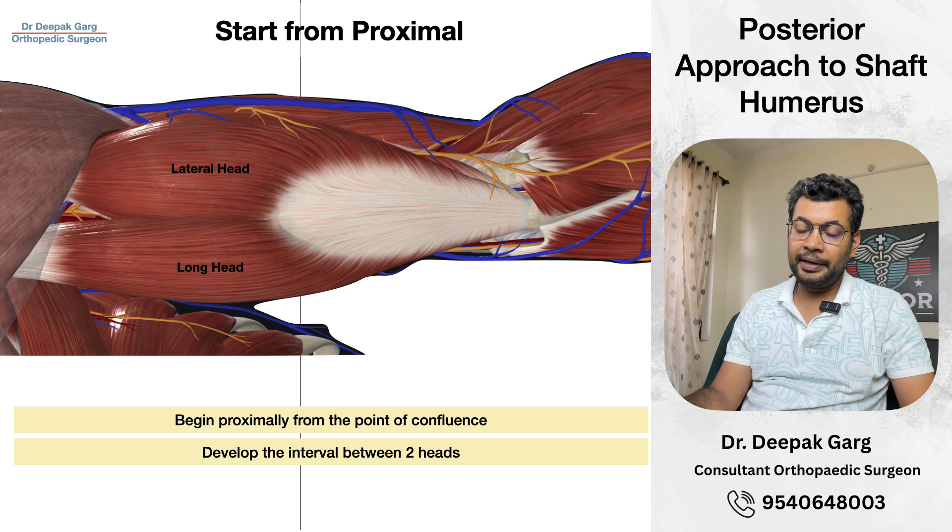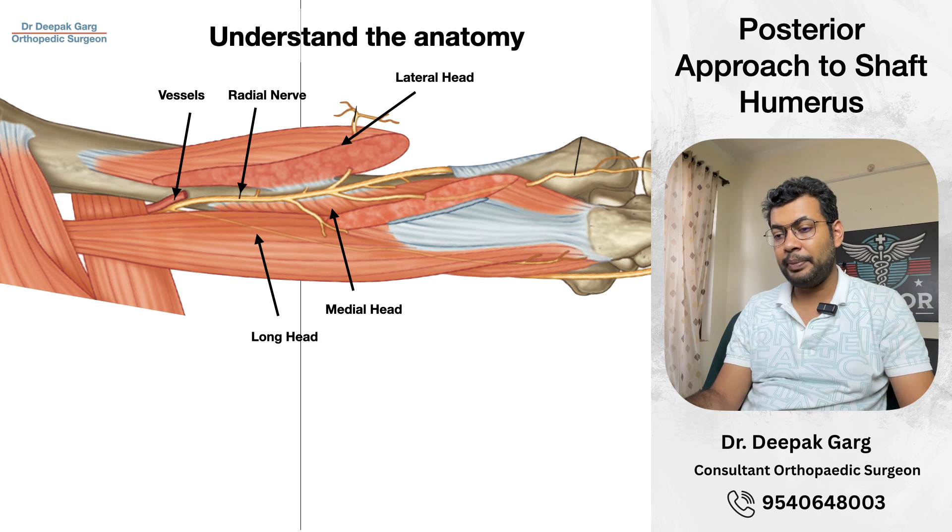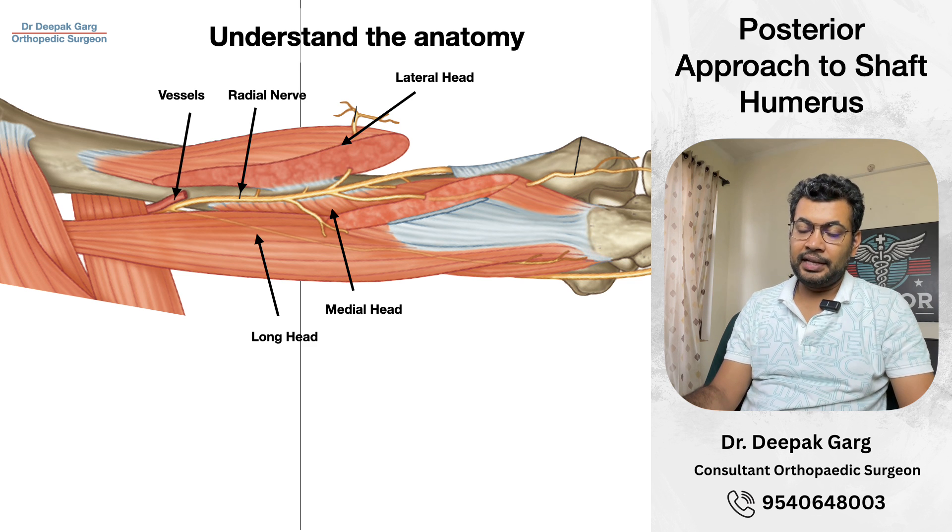When we develop the interval between the two heads — the lateral head and the long head — it is easier to identify the radial nerve. Once we identify the radial nerve, we separate it from proximal to distal. We should know that it passes from medial to lateral and then crosses into the anterior compartment. Once it is separated, we have muscle and periosteum in front of us. We incise the periosteum, expose the bone, and then we can perform our procedure, whether it is plating or whatever we need to do.